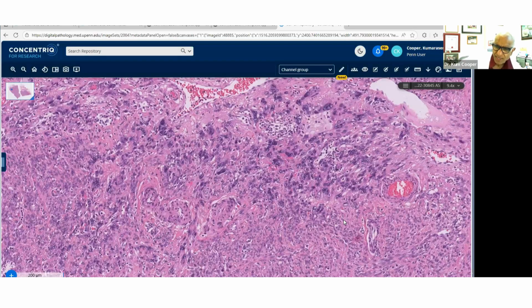I see there's a note here, and I thank you for that. No, it's not leiomyosarcoma, because remember, when you're thinking of leiomyosarcoma, let me back up a bit. Before I get to the leiomyosarcoma component, and just write LMS here so I don't forget, I was convinced that this was of Mullerian origin, in other words, from the GYN tract.